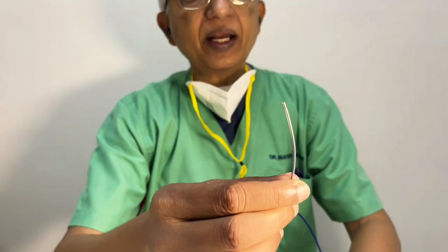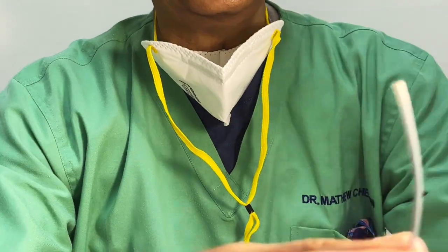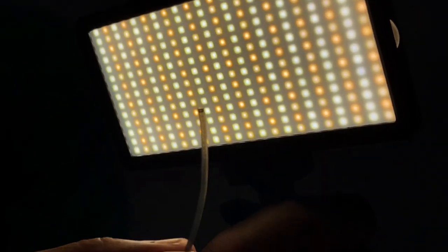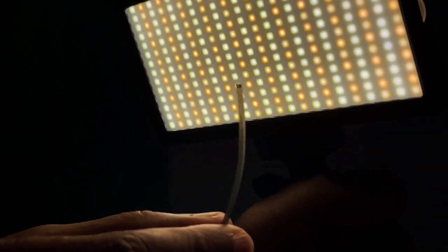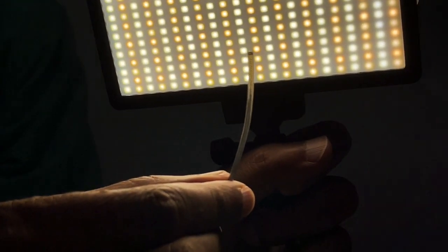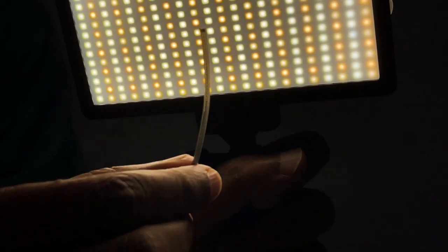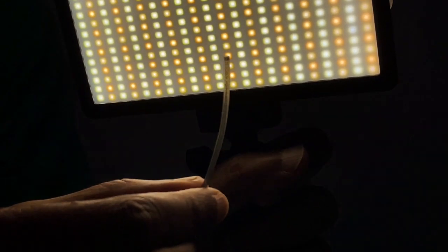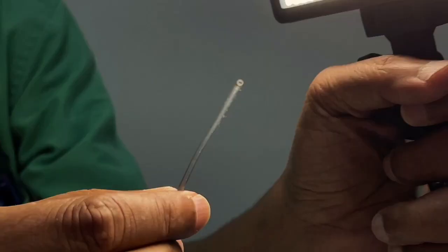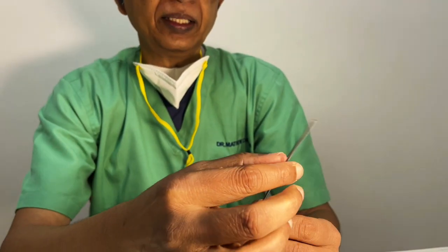So here it is. I'll try to bring the light again. This is Cat 7. The braiding over here is again just a spiral braiding. Can you see that? It's a single spiral braid. They do what's called a continuous braid. They say it is transition-less, meaning you cannot feel the transition, so it's got infinite transition, as from distal to proximal the braiding platform will change. If you see a catheter, you can now pick it up and have a look, and it's very easy for you to figure out what I'm saying. This is the concept.